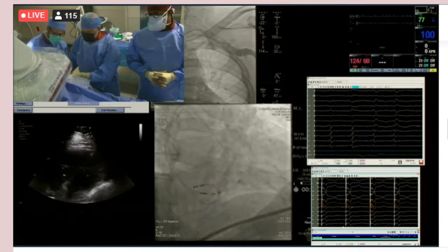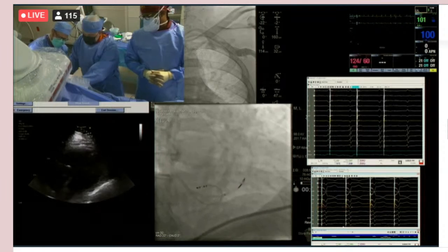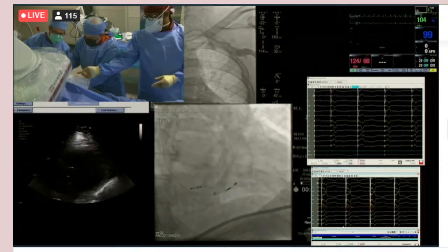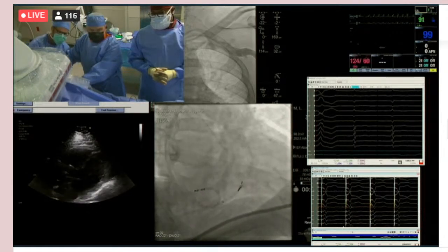Okay, Carol thinks she's smarter than I am, so generally. What did she say? She said that's a better spot echocardiographically. Okay. Looks a little high. But Carol says it's good. I'm going to try it.